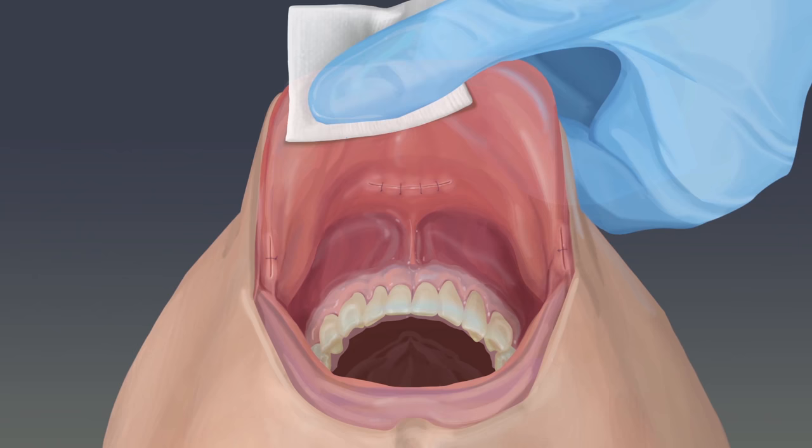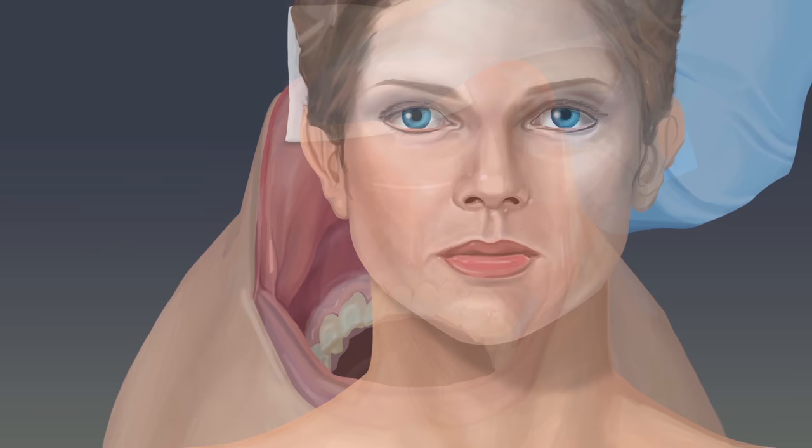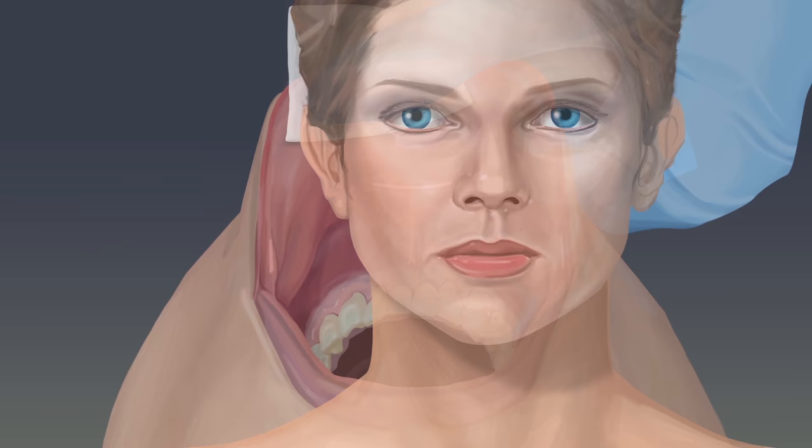At the end, diseased tissue is placed in a small pouch to remove it. Once the procedure is over, absorbable sutures are used. A pressure dressing is placed overnight. Once healed, patients will have small, invisible scars inside the mouth.